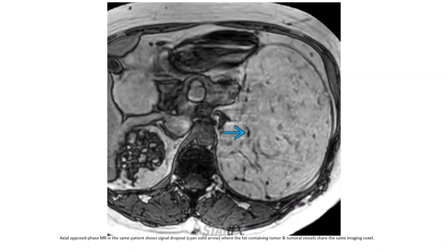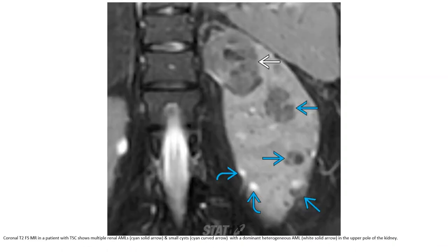Opposed-phase images in the same patient show signal dropout where the fat-containing tumor and tumoral vessels are present. T2 fat-saturated images show multiple bilateral angiomyolipomas with cysts and a dominant heterogeneous angiomyolipoma in the upper part of the kidney.